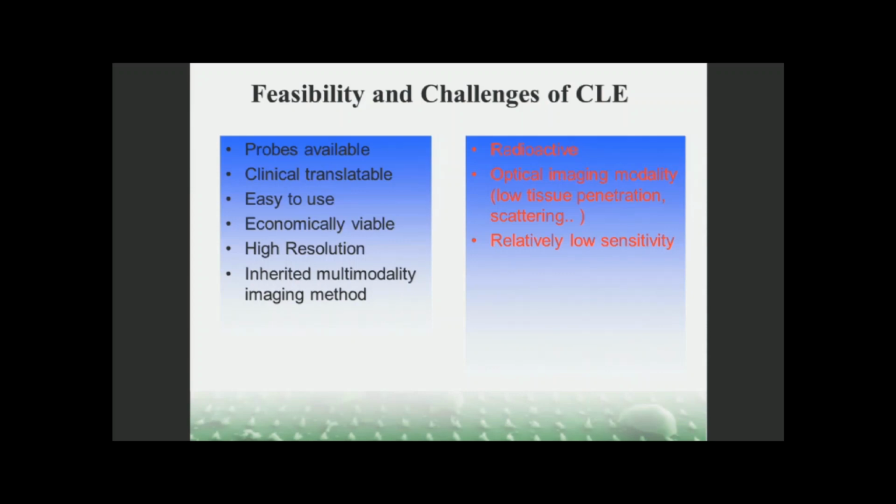I want to give a brief summary of our work. As Dr. Grimm already summarized the advantages of CLI, Cerenkov Luminescence Imaging, I think the CLE system has similar advantages and disadvantages as CLI.